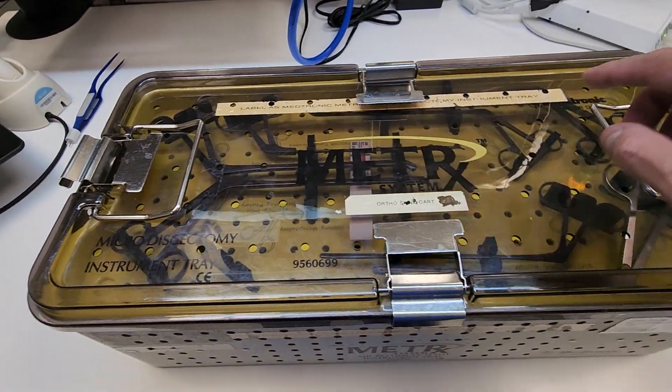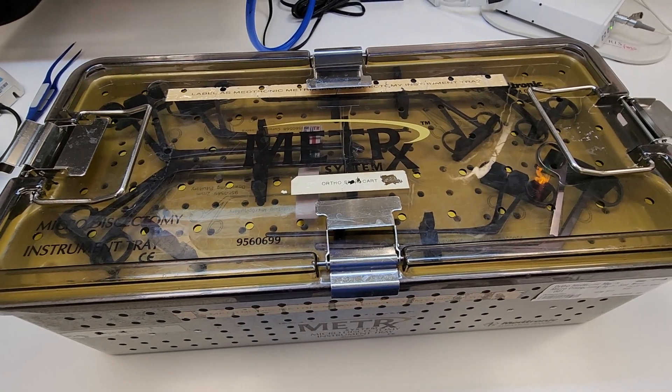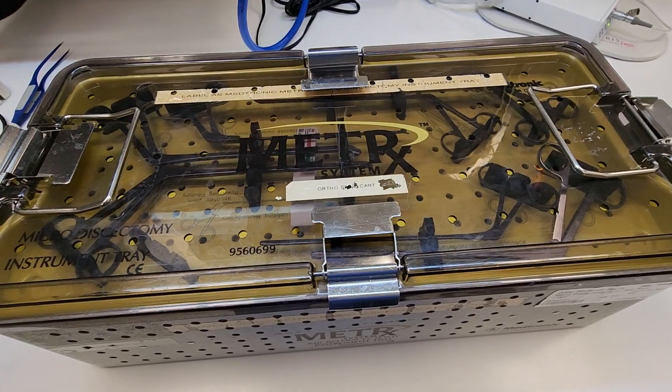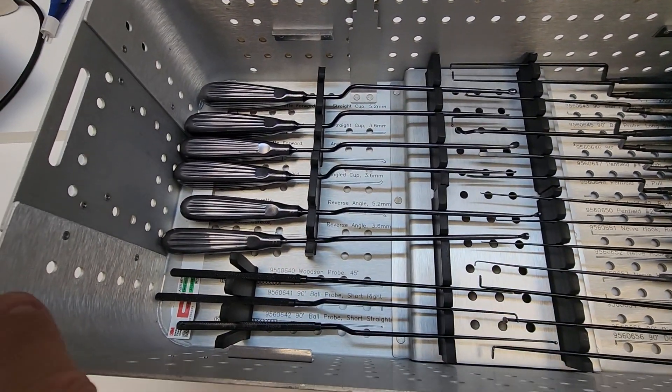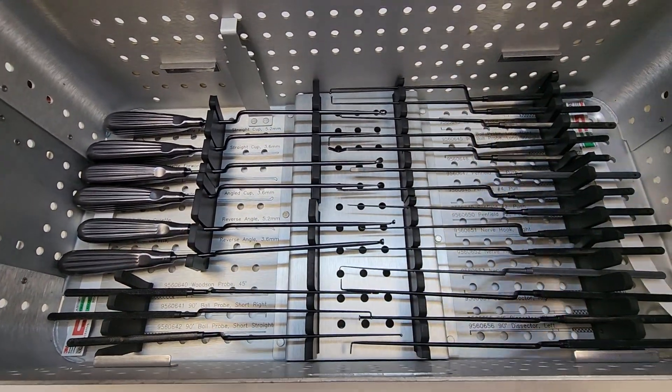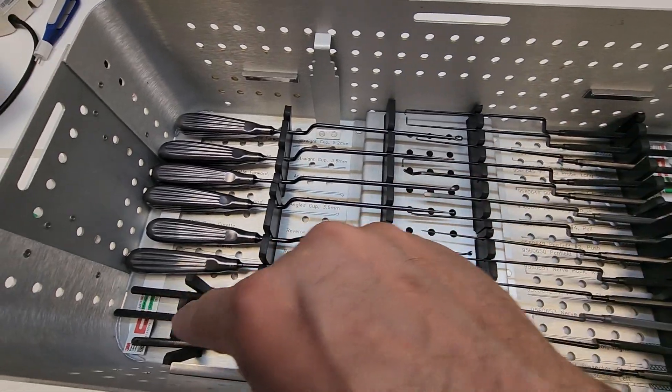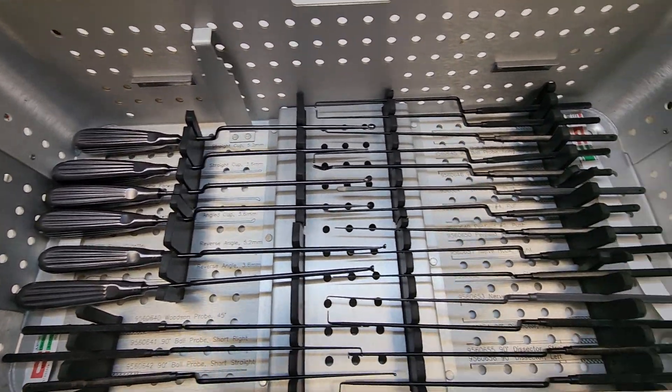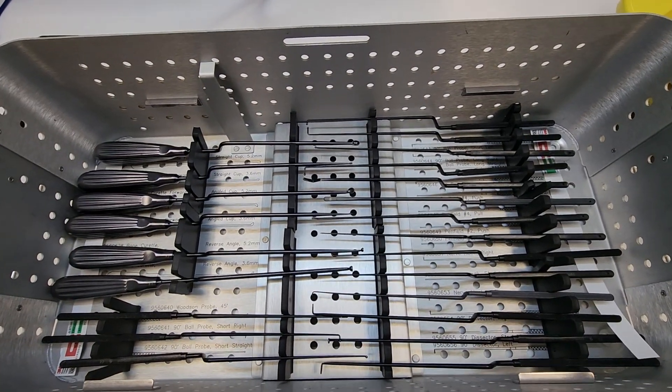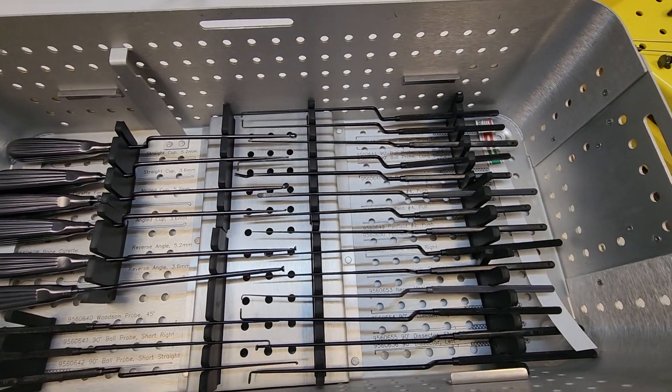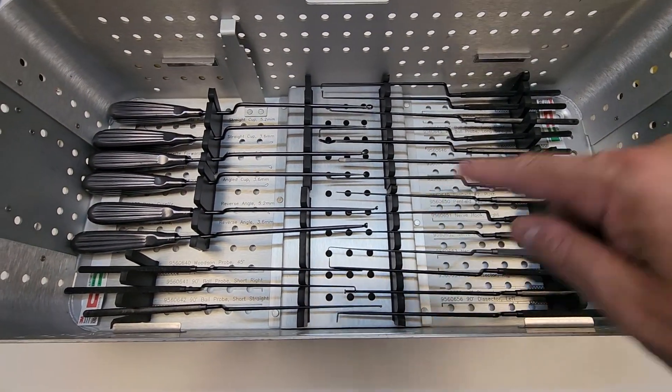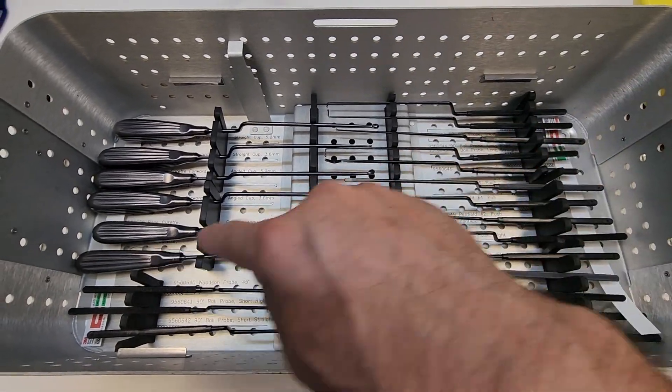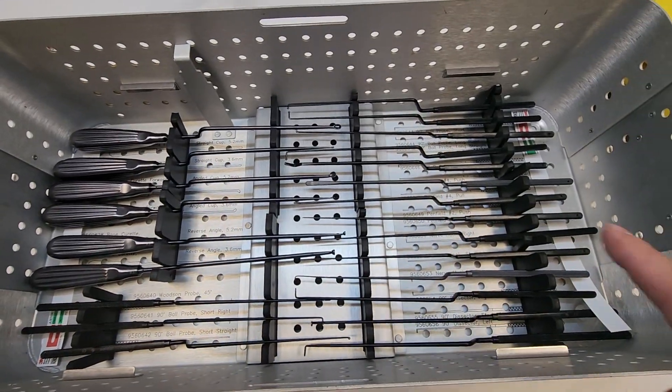What's that going to look like? So I'm not going to go through the motions, I'm just going to show you what it looks like. Now this tray is going into a container. One on the opposite side, opposite corners, right, technically diagonal. It really doesn't need to be diagonal, it needs to be on the opposite corner. It's the hardest to reach. You can determine that in your facility, but typically you'll see individuals place it diagonally. It just needs to be opposite corners.